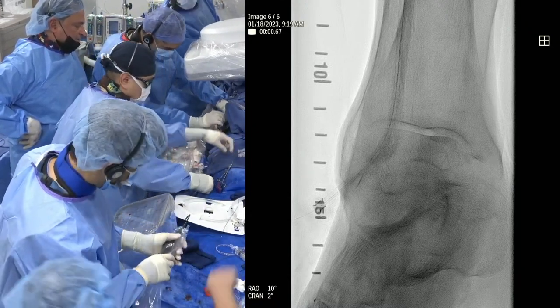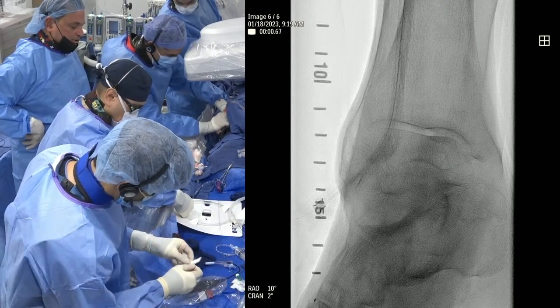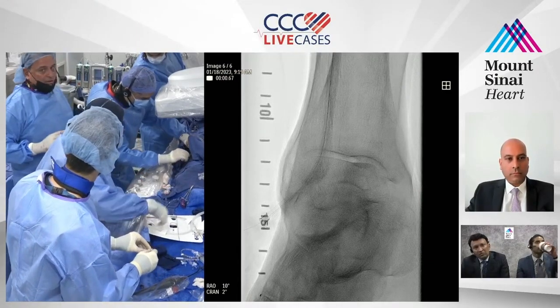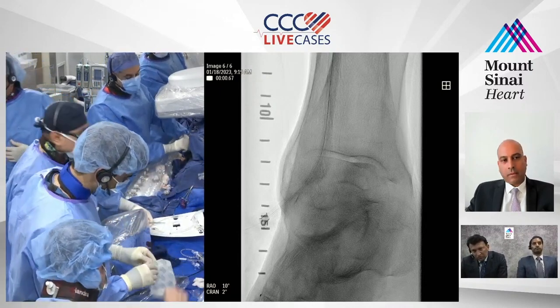So let's go now. We're just going to try to shockwave. Srini, Vishal is going to hold. We're going to hold taut here, and Ajit is going to hold taut up there. Okay, what are we shockwaving? The pop and the distal SFA? I think right now just start with the pop and distal SFA and then internalize the wire. Put the wire up into the common femoral and then go ahead.